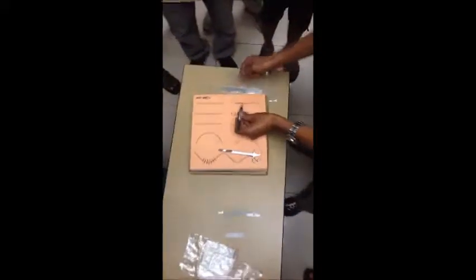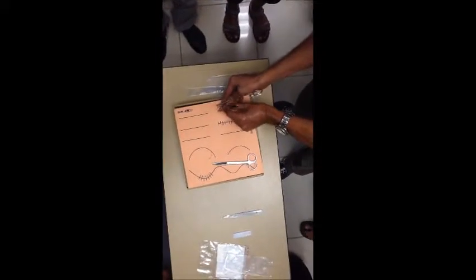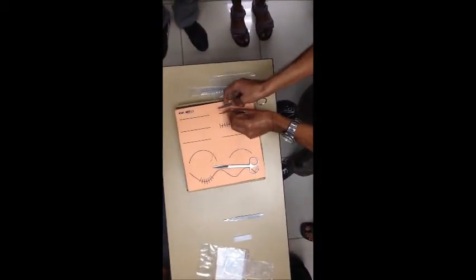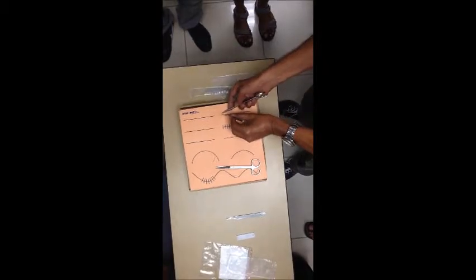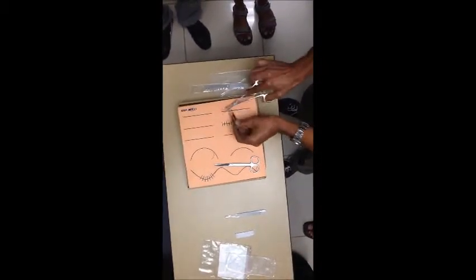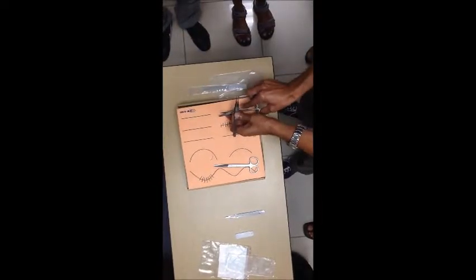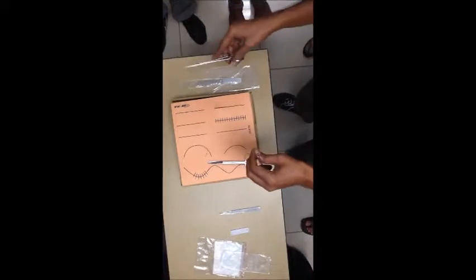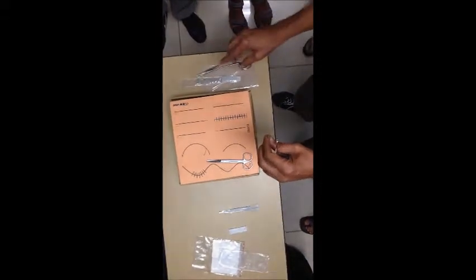The first step is we have to take a bite, full thickness as usual. Assume this is the linea alba, and you take a full thickness bite on the other side without taking your needle out. Push it, grab hold of this end and pull it out. Always remember there's an assistant on the other side who's assisting you.